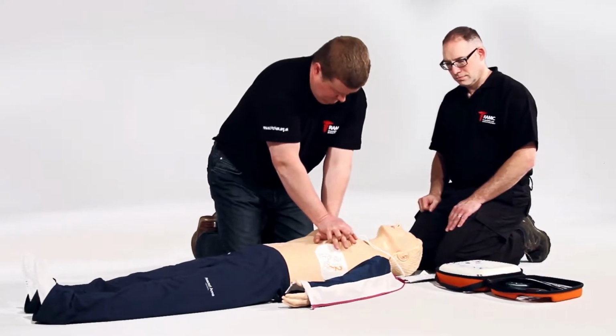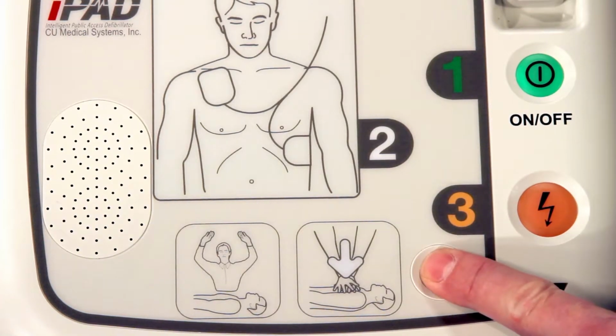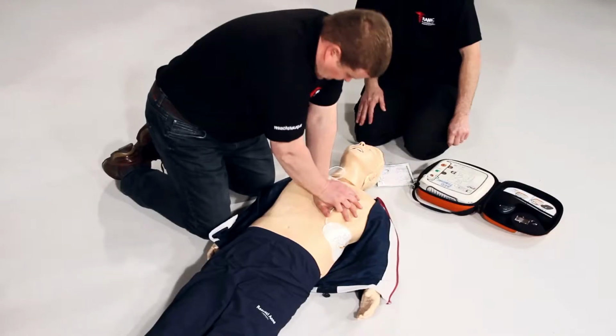Press the flashing blue i button for CPR voice prompt. First.